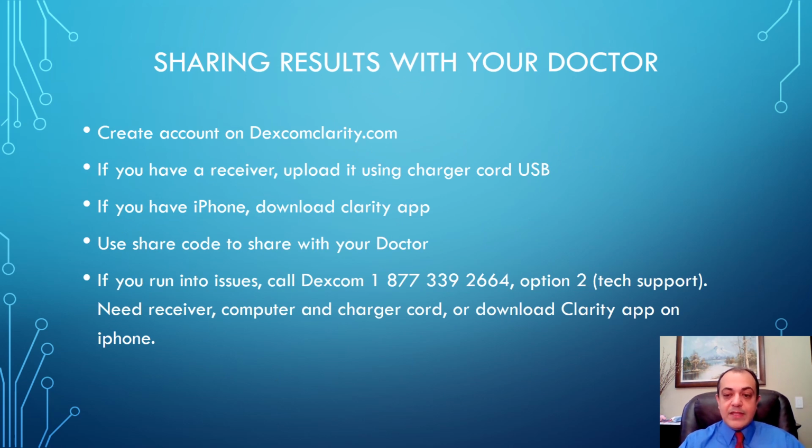So again, to put it in steps, first thing that you need to do is to create an account. And then if you have a receiver, you upload it using the charger cord USB. If you have an iPhone, you download the Clarity app and you use it to share the results. And you can use a share code, which is unique to each clinic, to share with your doctor. Again, if you run into issues, it's the same thing. You call a number and you ask for tech support, but you have to have everything ready.